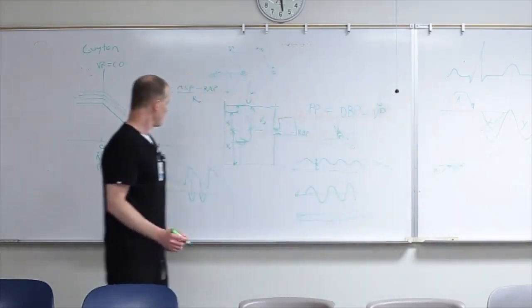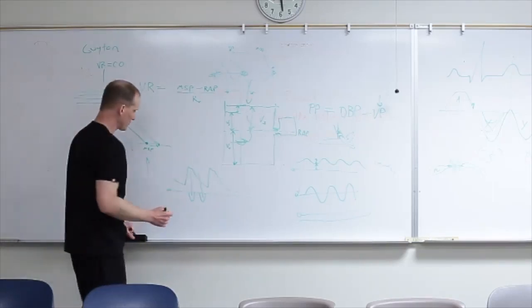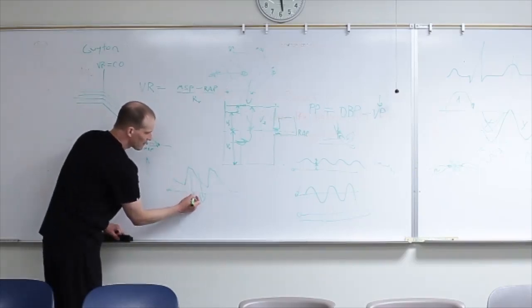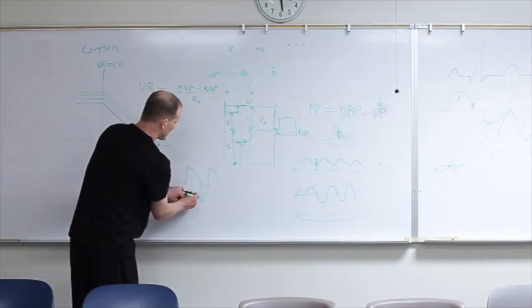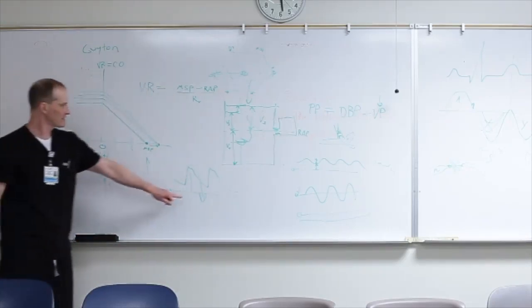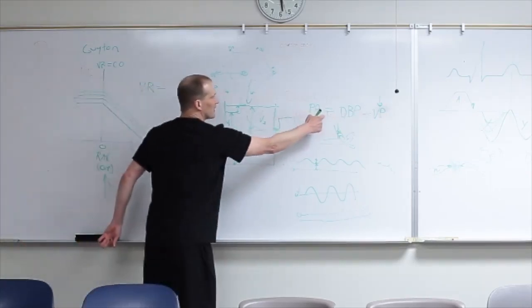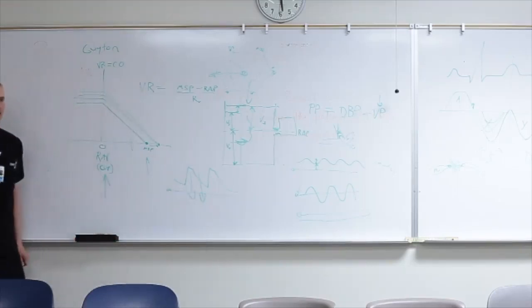But just like what happens with our central venous pressure waves, as the pressures go up and up, this one will get smaller relative to that one, and then it just disappears. So this is an extremely congested kidney with very little perfusion. This is a kidney also, it's just not as bad.